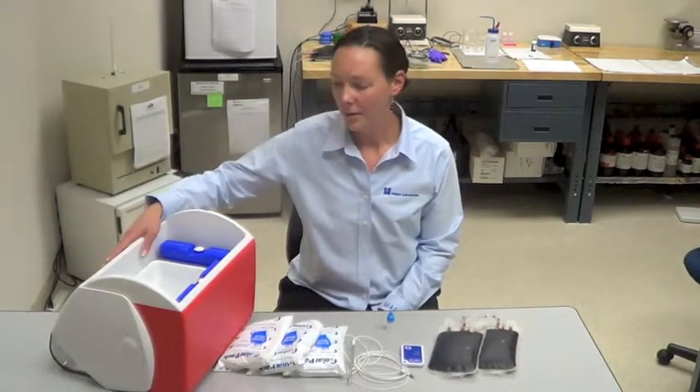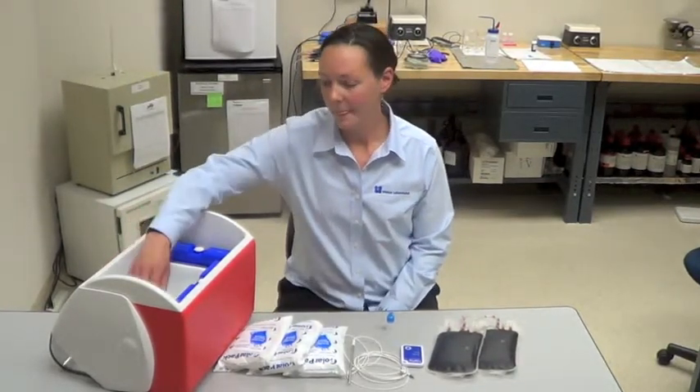Two bags of simulated or expired blood product, three cooler packs, your cooler and freezer packs, and a container with which to put your simulated blood or expired blood products.